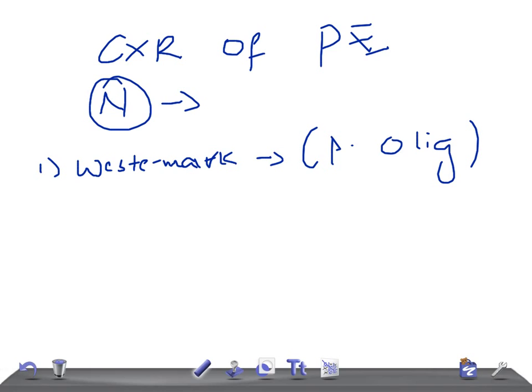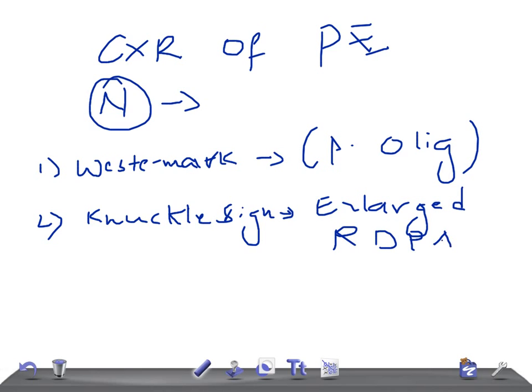The second thing is knuckle sign, also known as Palla's sign. This is an enlarged right descending pulmonary artery. Remember, this is very important, and it's also known as Palla's sign.